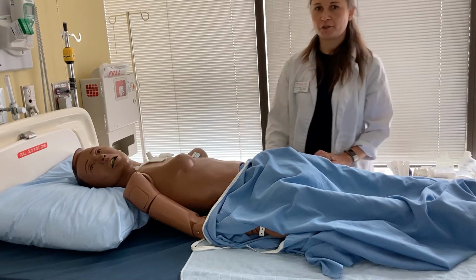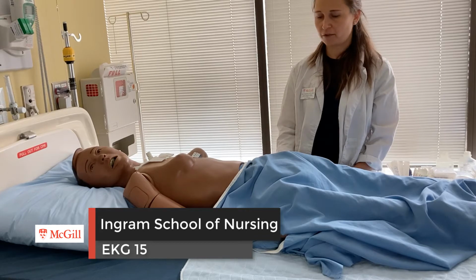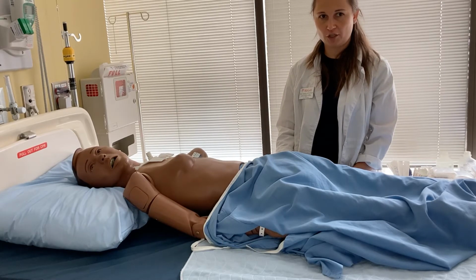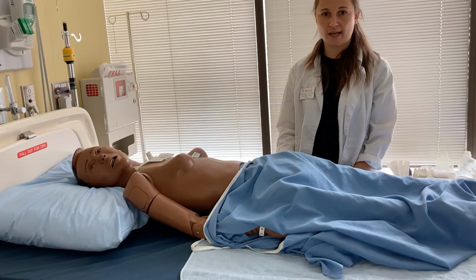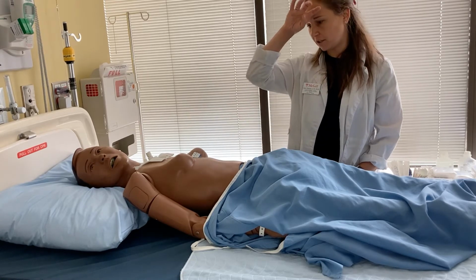When you work in coronary care units or in an emergency department, as well as in some other placements, you might be asked to do a 15-lead EKG or a posterior EKG or a right-sided EKG. So now there are different variations of EKGs that we can do from a regular 12-lead. So it's always a good idea to confirm with your physician what it is exactly that they want to view when we are talking about the planes of the heart.